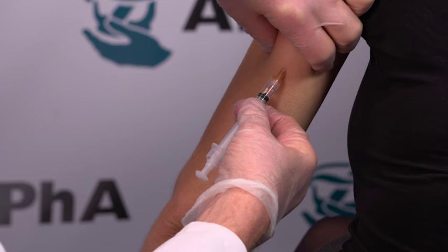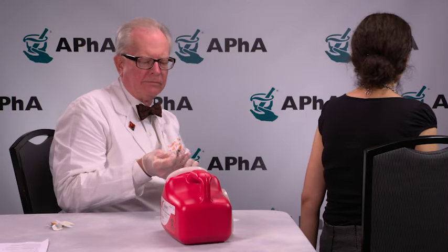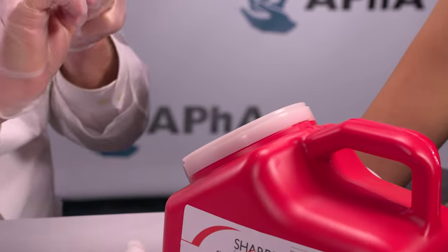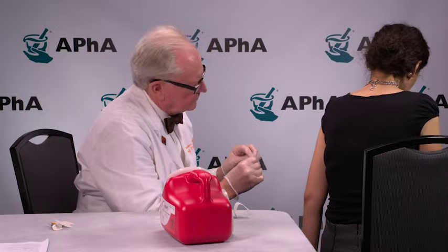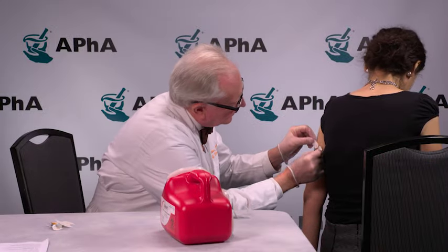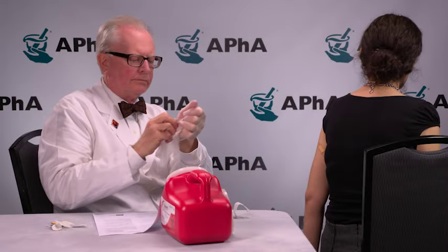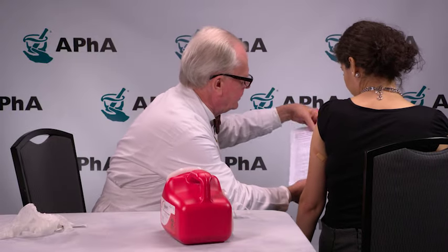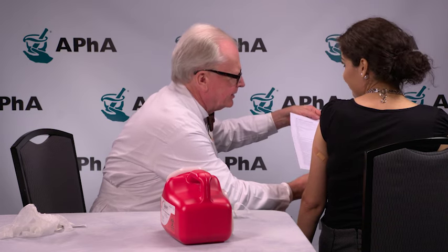While supporting the patient and the syringe, depress the plunger in a smooth and coordinated manner. Quickly withdraw the needle. Immediately activate the safety device. Dispose of the syringe and needle into the sharps container. Press the cotton or gauze over the injection site and secure this to the patient using the adhesive bandage. Remove your gloves and wash your hands. Change your gloves between patients. Provide your patient with post-injection counseling and follow-up instructions. Document the injection given while maintaining compliance with all legal requirements.